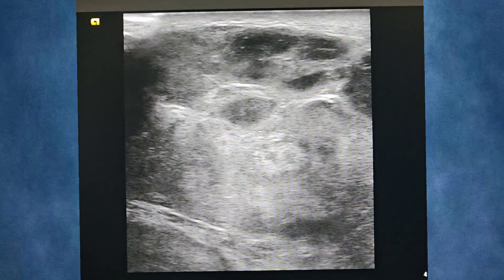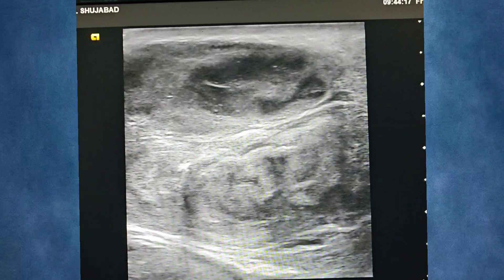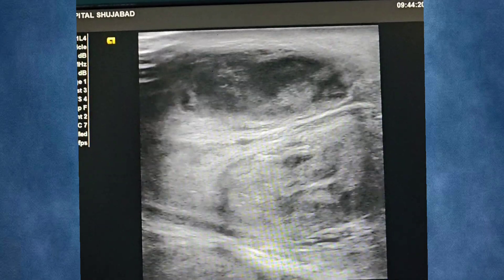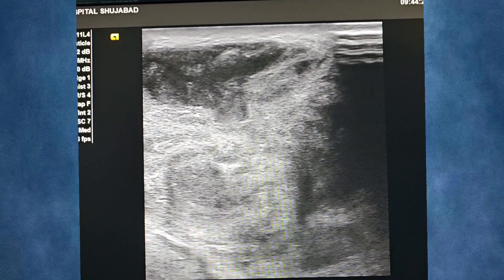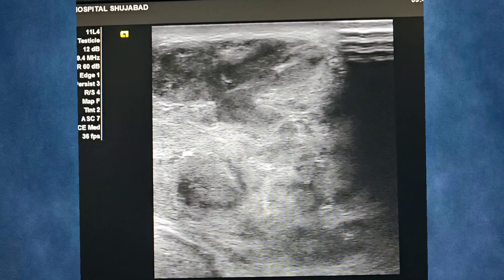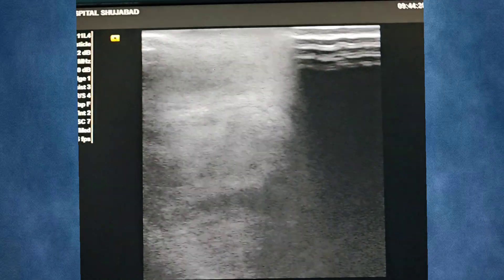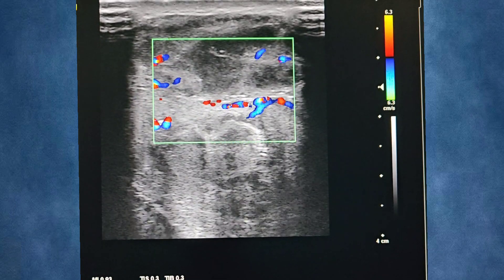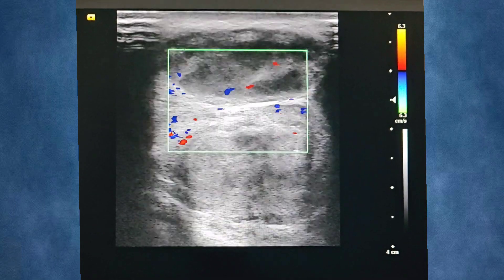The grayscale ultrasound showing the right testicle, which is heterogeneous in appearance, showing multiple internal hypoechoic areas with movable debris and echoes. This is transformed into a complex heterogeneous mass lesion on the Doppler ultrasound, where there are some avascular regions with associated surrounding increased vascularity.